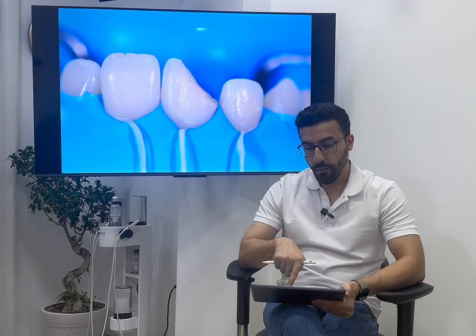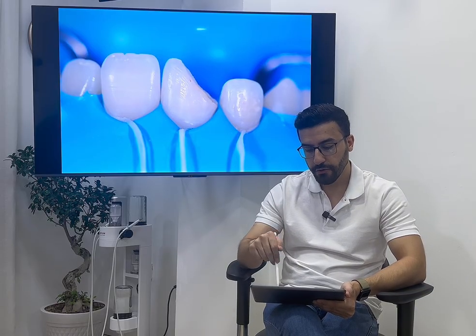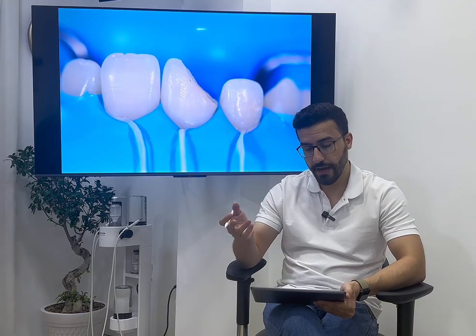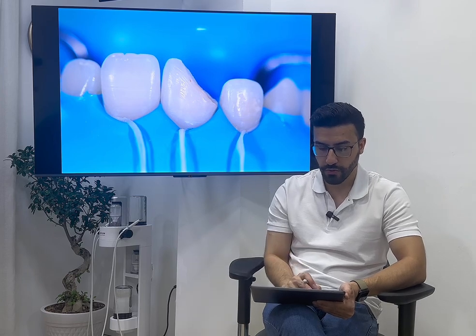Second, when you isolate the teeth, most of the time you take more than 3 minutes. So when you take more than 3 minutes, the tooth will desiccate. If the tooth desiccates, it will become brighter, and the shade selection will be brighter, and the result will be horrendous. So also always make sure to make your shade selection before starting.